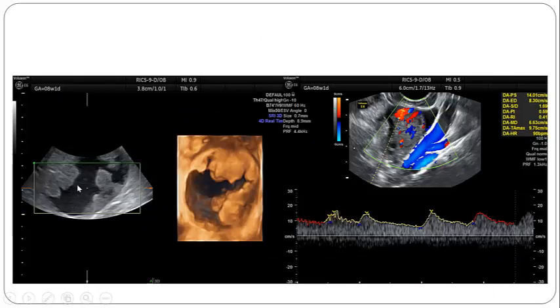This is the 3D ultrasound. Does not add too much because in the 3D ultrasound we just found the solid parts causing this solid papillae projecting inside. In the early pregnancy, we must also do Doppler for the uterine artery, and this is the Doppler for the uterine artery, showing normal monophasic wave with normal RI and PI in this case.